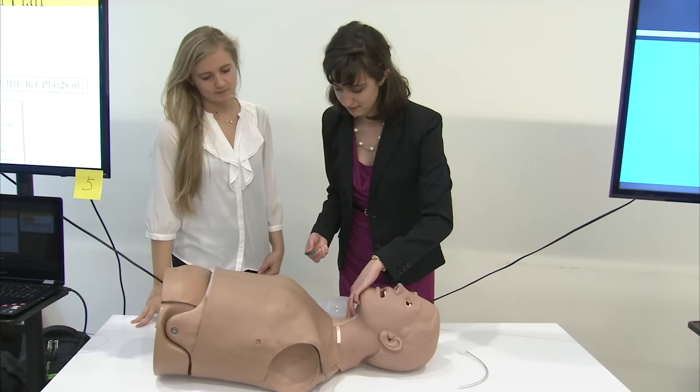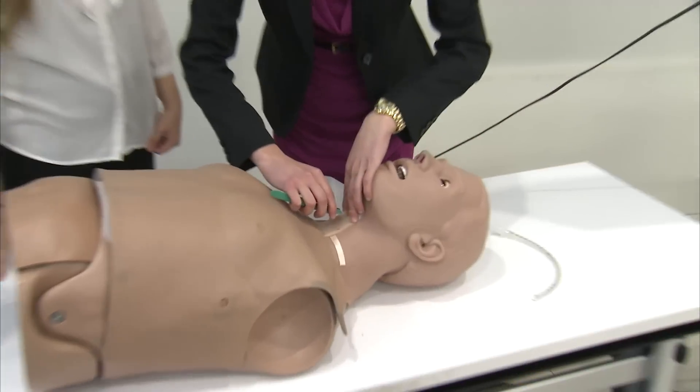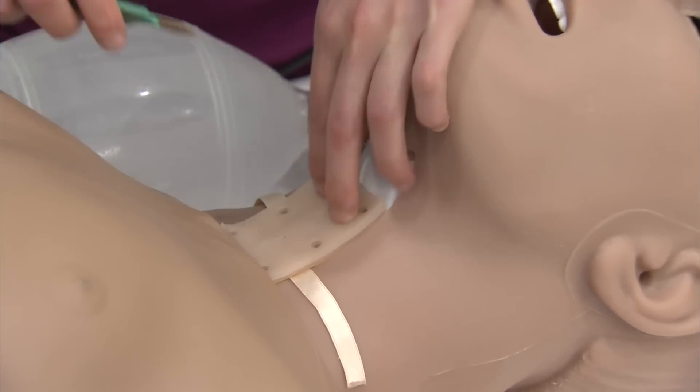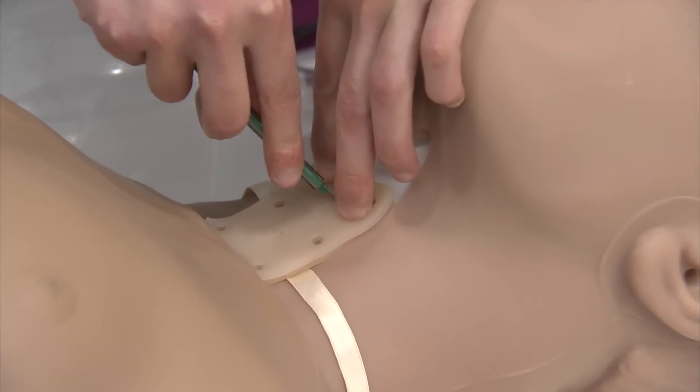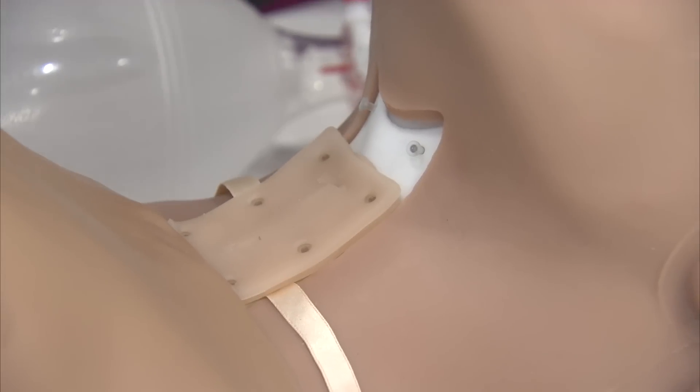First she's palpating the neck to find the cricothyroid region right under the laryngeal prominence, and she makes a vertical incision to cut through the layers of skin, fat and underlying tissue. Finally, one horizontal punch incision through the cricothyroid membrane.